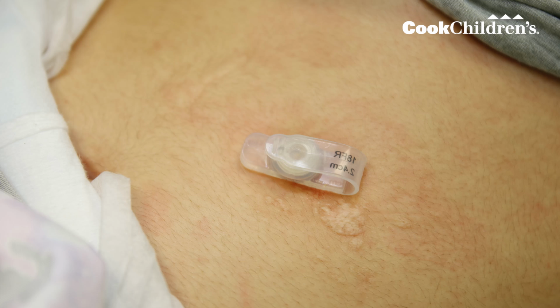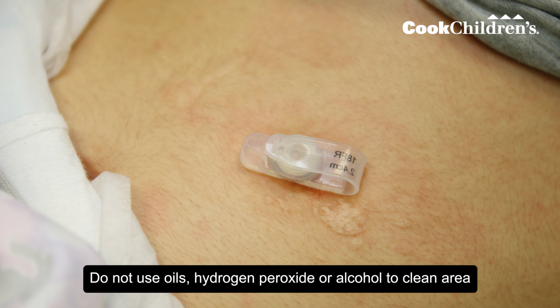If the skin is healthy and there is no leaking around the G button, then leave the site open to air. You do not need to use ointments and dressings unless there is leaking or your provider has told you to use them. Do not use oils, hydrogen peroxide, or alcohol to clean the area. These can irritate the skin.